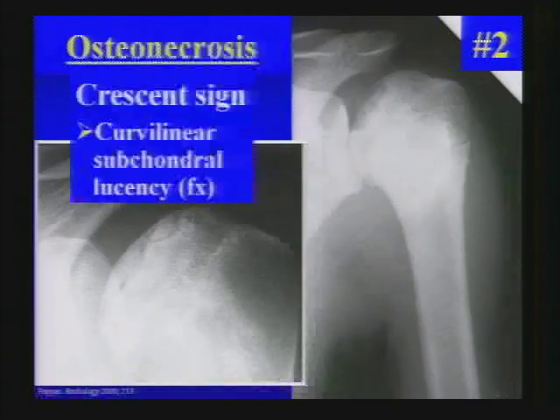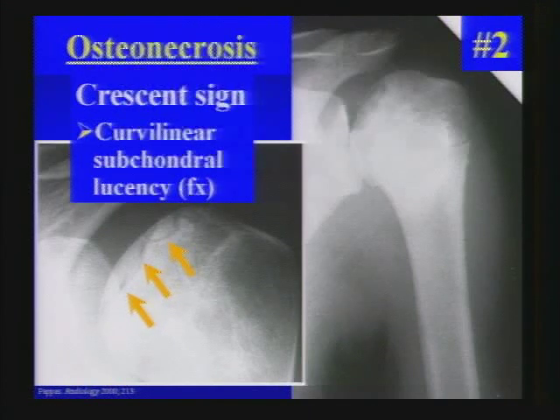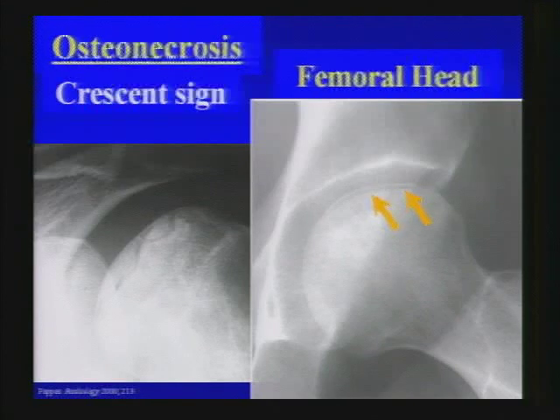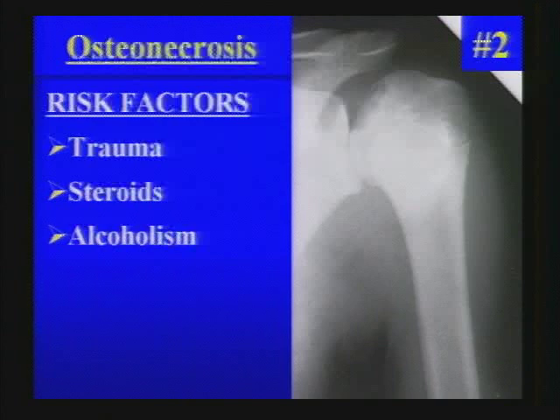Here's a frontal cone-down view of the shoulder. This is a case of osteonecrosis. What we see is a crescent sign — the curvilinear subchondral lucency due to a fracture in necrotic bone. It's reminiscent of what we see in the femoral head and is a classic boards trick: showing a classic feature in an unusual location. The three most common risk factors for osteonecrosis are trauma, corticosteroids, and alcoholism.